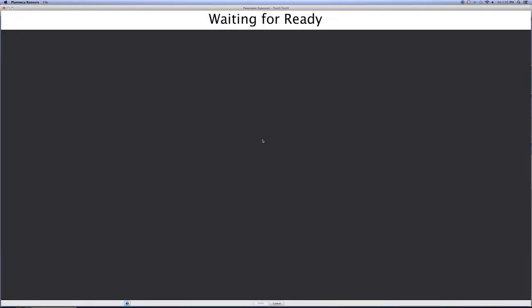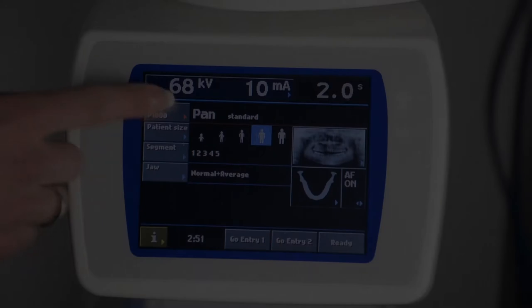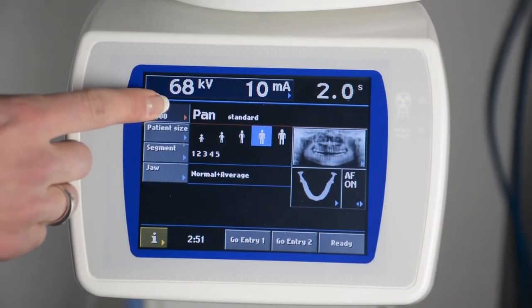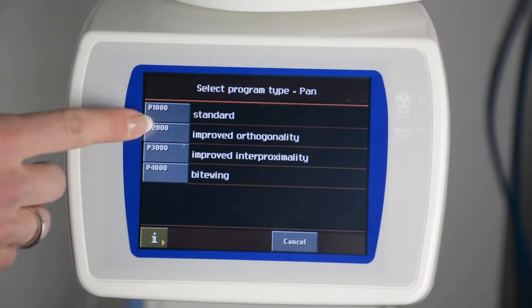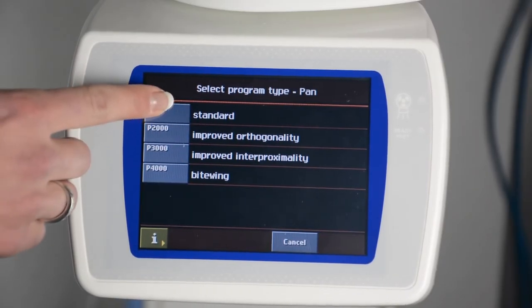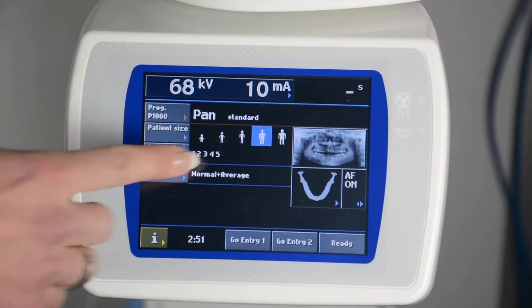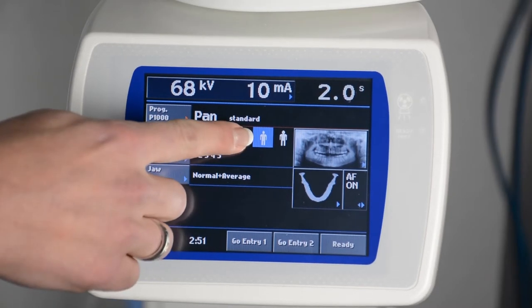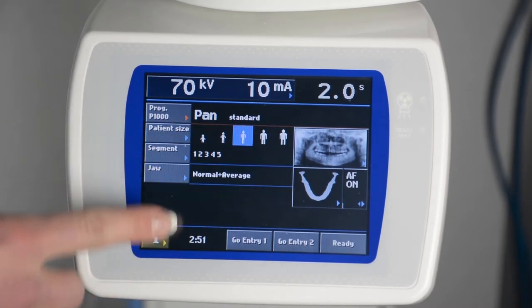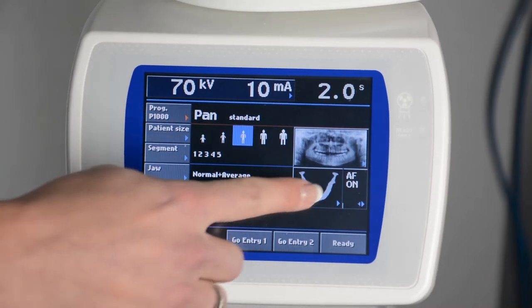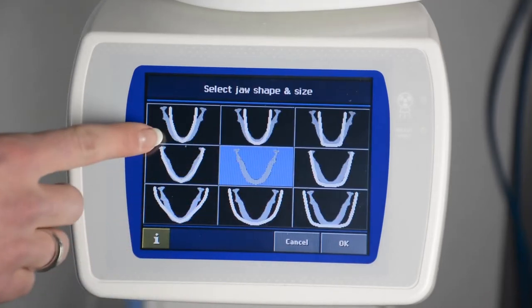First, prepare your imaging software until your computer screen says 'waiting for ready.' The appearance of this screen may vary from software to software. Next, select Standard Panoramic from the ProMax main menu and select the patient size. Evaluate the patient's dentition and choose the appropriate jaw shape and size.